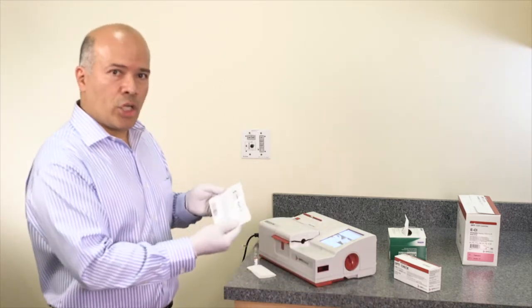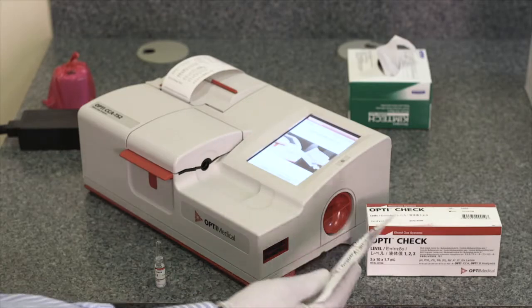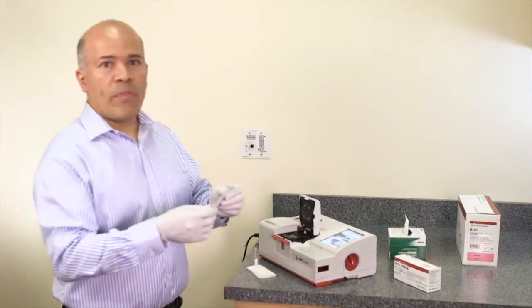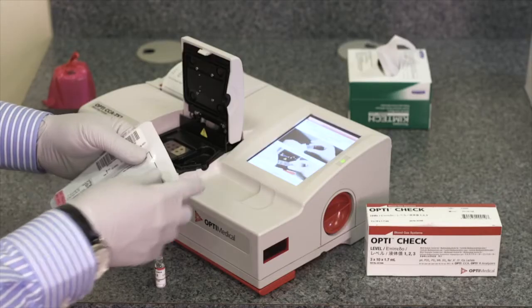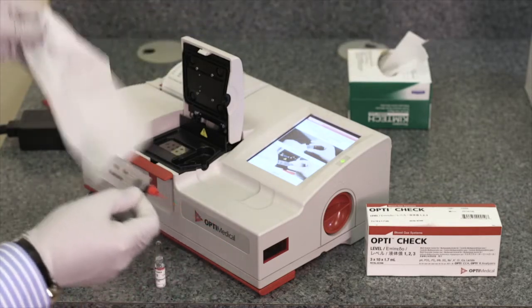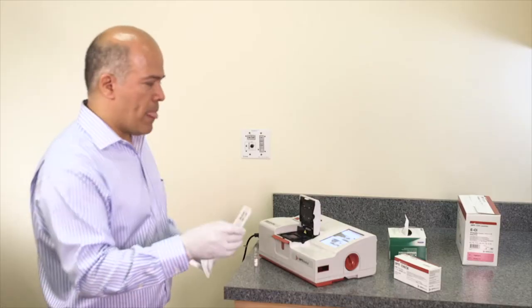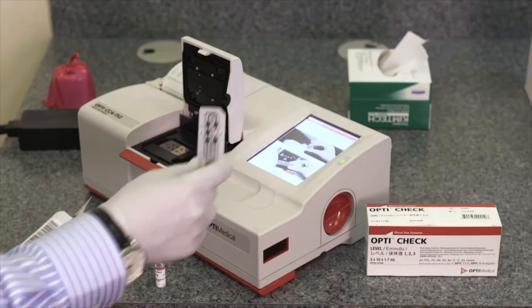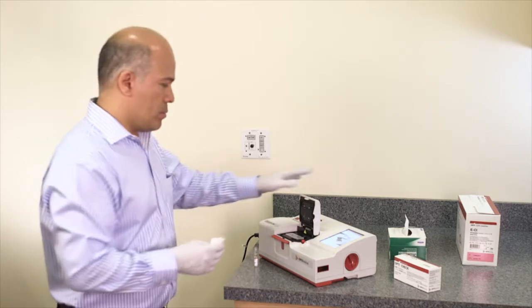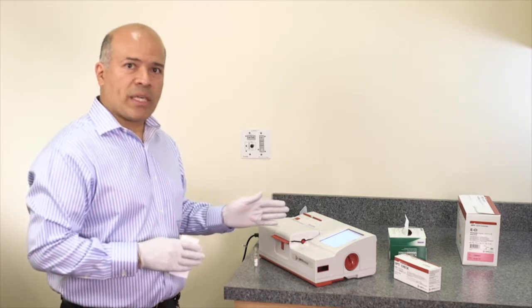An OptiCassette is needed to run the liquid controls. Follow the instructions on the prompt screen: open the cover, open the pouch on the top, remove the cassette, hold the cassette on the finger grips, wipe the cassette, and insert the cassette on the chamber. The instrument then prompts to close the cover and cassette calibration begins.